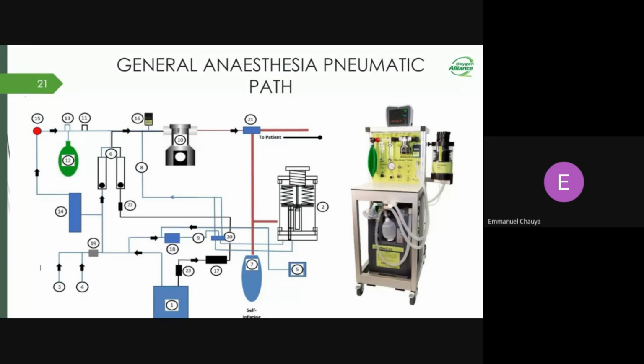If you follow the red line below there's written 7. This is just to help in manual ventilation, which we'll look in a moment. So maybe you want to operate this machine where you don't have power and then the UPS has run out, but you still want to do your OR procedures. You would use this and administer the normal air to the patient.